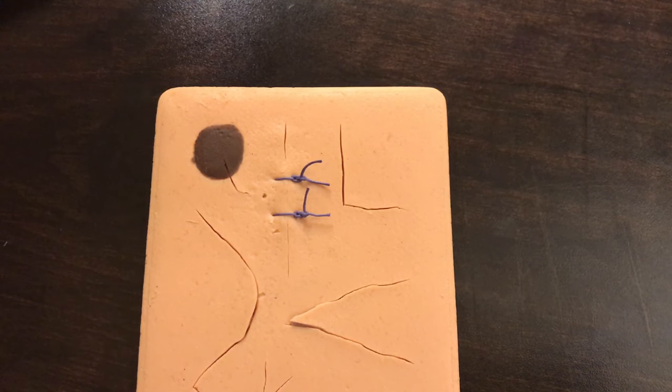I wanted to do a quick demonstration of suture removal, because most of the time we might not think about it. But when we're removing sutures from the skin, these have been within the skin maybe 3, 5, 7, 10, or 14 days, and so the normal skin flora bacteria has started to colonize over that area for sure.